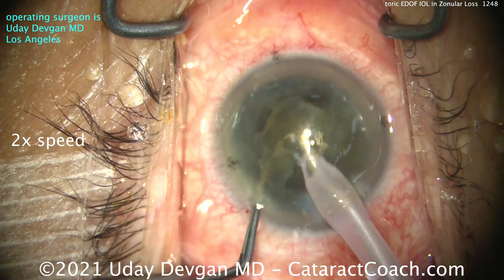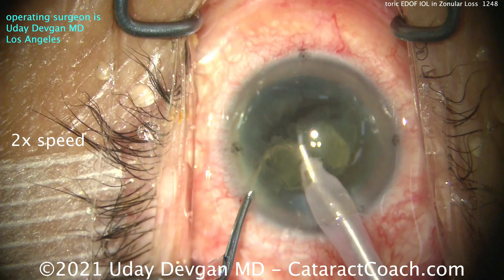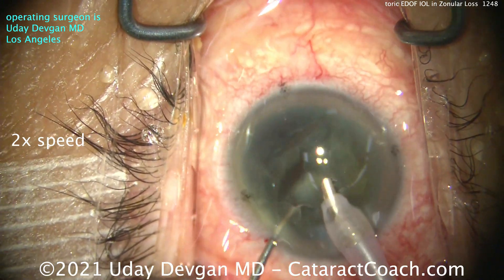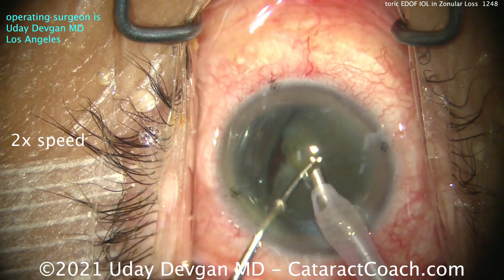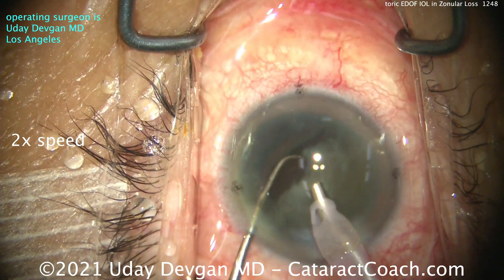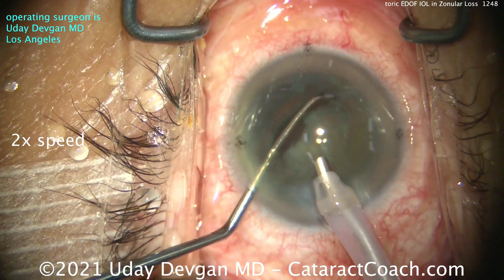The video is at two times normal speed. You see the epinuclear shell, which is a little bit of protection for me. And then I notice in that top left corner — we're going to get a clear red reflex. Look at that coming up. Whoa — that's zonular absence.